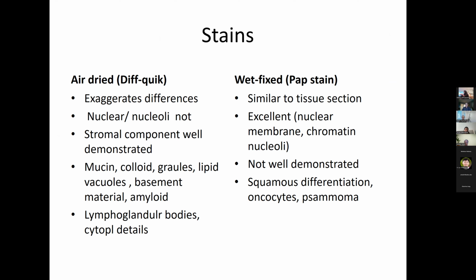In the Pap stain slide, it'll take 24 hours because this goes into the lab and has to have a long process for staining. But you will see within 24 hours, the slide material is more excellent because it has nuclear membrane details. But for your immediate interpretation, a Diff-Quik is good for assessing adequacy as well as maybe giving a preliminary interpretation.